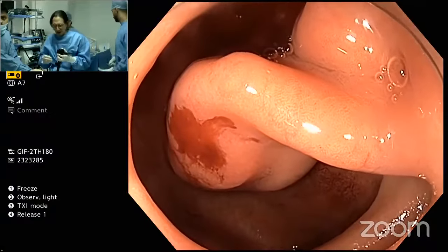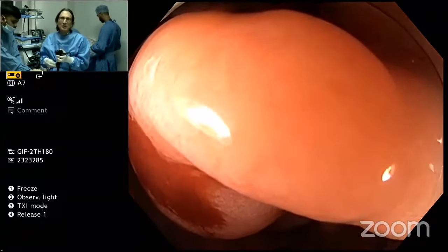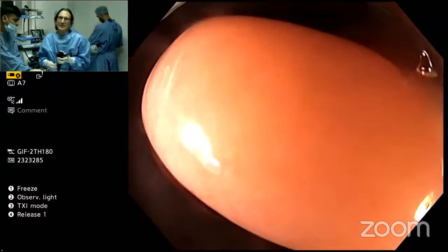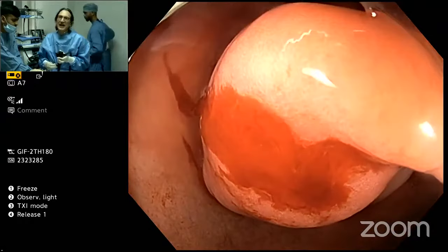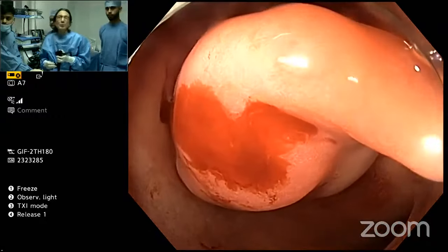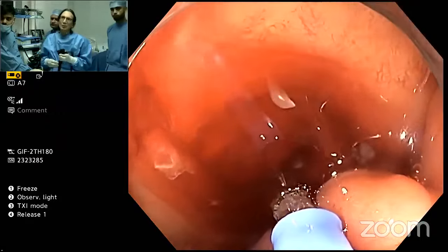It's really just to show you. Unfortunately, I couldn't demonstrate it with this, but I will demonstrate it afterwards if we have time, just on the wall, because it's very safe. It just is an anchor. All right, so let's just loop this now because it's very easy to do just with the loop. But you saw how with the anchor, I was able to pull it into the antrum, right? So I can't do that now, but we'll open up now the loop. So open.